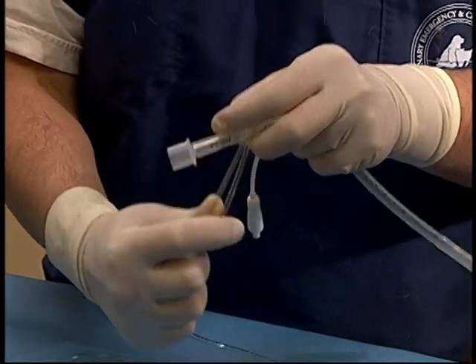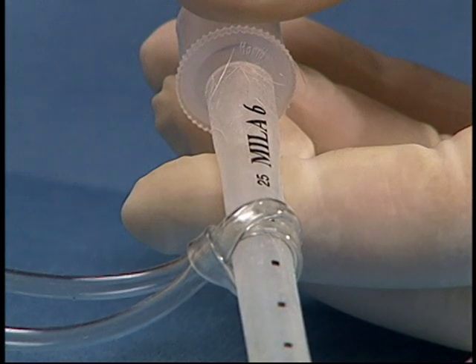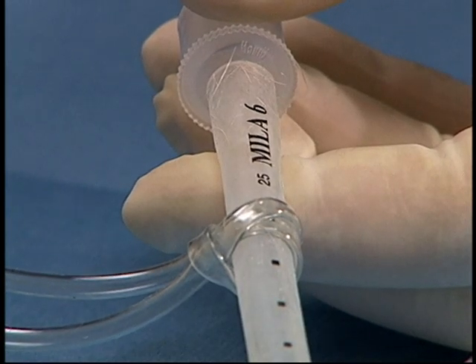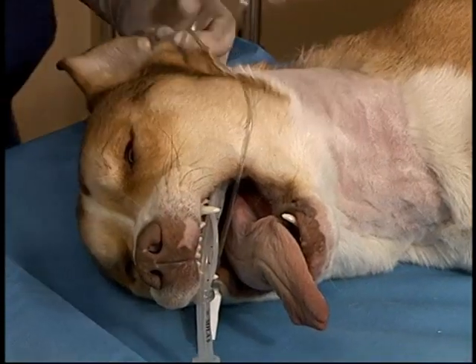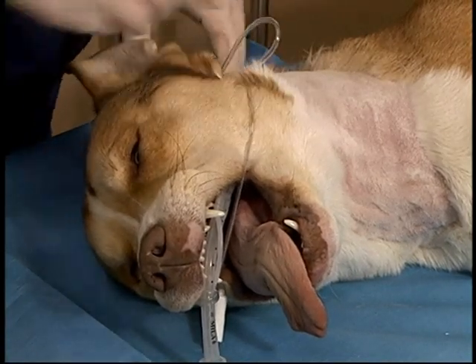The knot is locked down and can easily be released by using the thumb pushing out on the outer edge of the loop. This can then be tied around the back of the animal's head. This tubing is preferred because it does not get caught in long fur and when wet is still easily released.